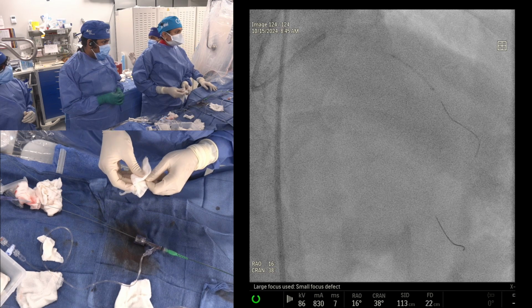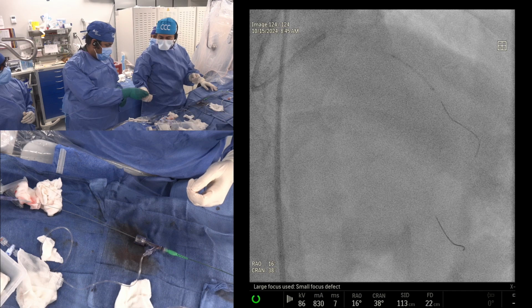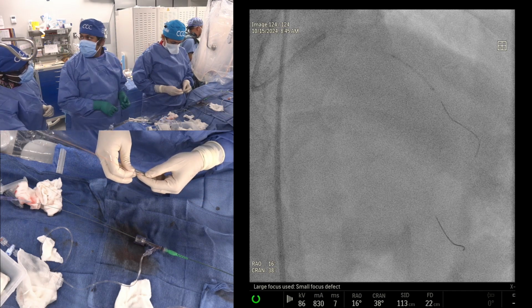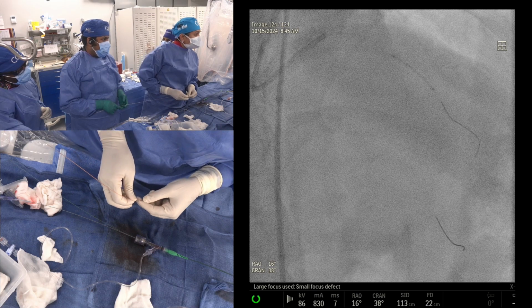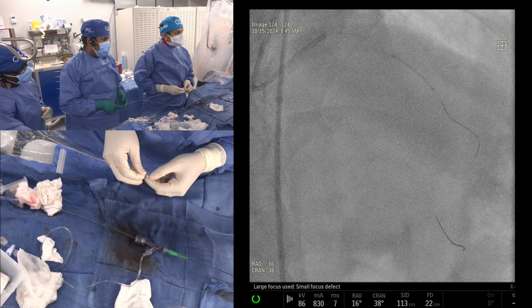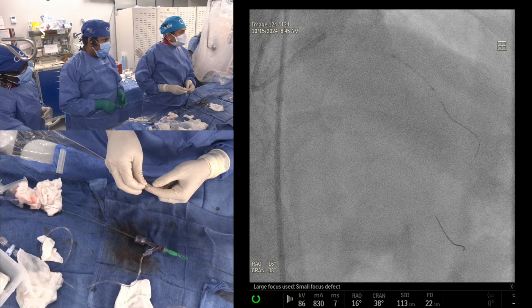Even the company does not promote it. The company has not done it. I can tell you over the time, I probably have done 100 plus mini crush with a 6 French. The only thing is the stents are less than 2.5 millimeter. 2.5 also is okay, and the length, 48, I never tried both of them. Like 23, 28, 2.5 both will go through 6 French.